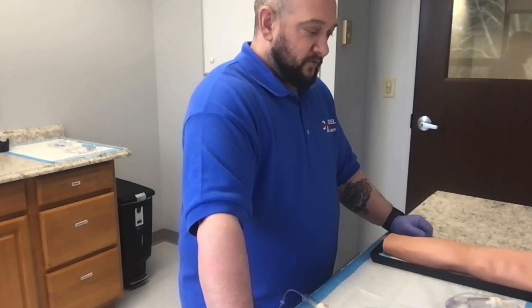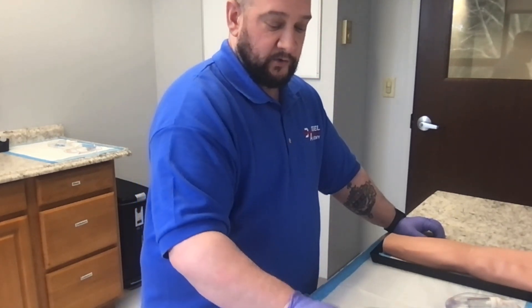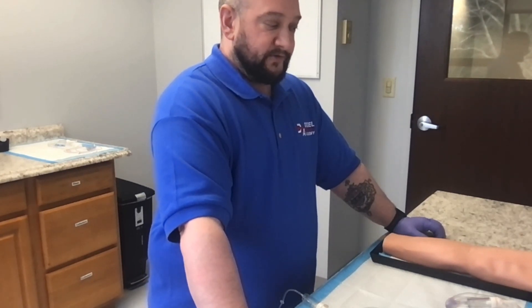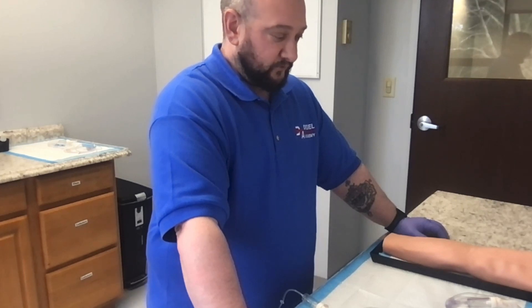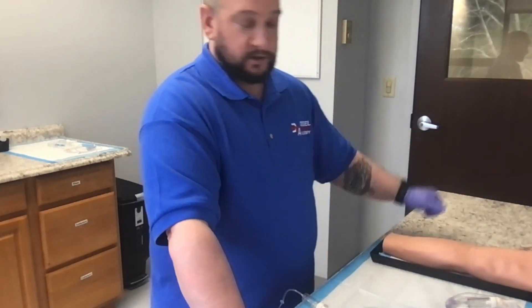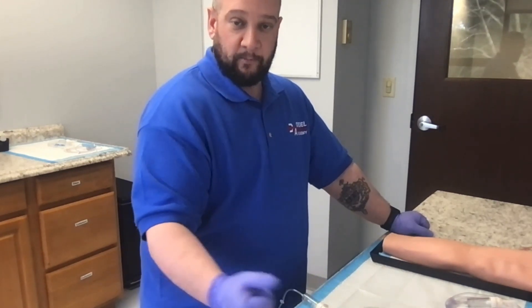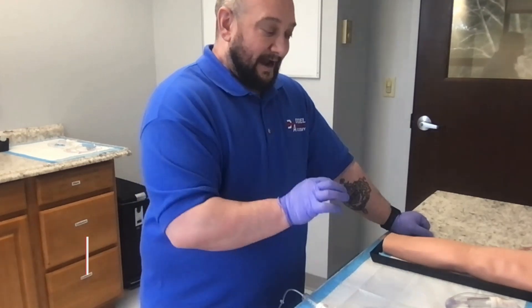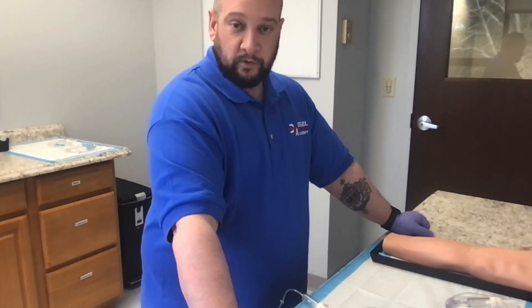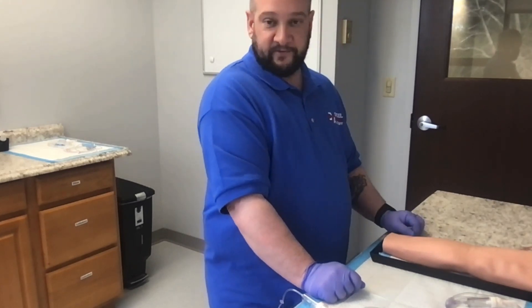Welcome. Today we're going to go over our IV start. Generally in paramedic school, this is one of the stations that you test out of to determine competency level. The first thing is making sure that you have all the equipment you need to be successful. We're using the training arm — these have big ropes that are generally easier to cannulate, allow for flash, and allow the instructor to see whether you've been successful with your venipuncture and blood return.